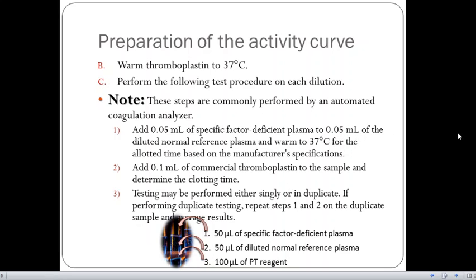And it is warmed up to 37 degrees Celsius for a little time. And then after that, we add 0.1 ml of the commercially available thromboplastin to the sample and we determine the clotting time. After that, testing may be performed either singly or in duplicates. If performing duplicate testing, repeat steps 1 and 2 on the duplicate sample and average the results.